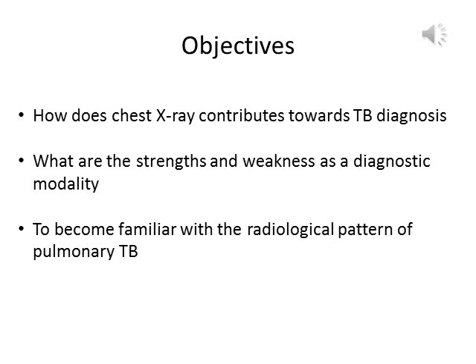However, practical experiences and many studies have shown that no radiographic pattern is diagnostic of TB. Many diseases of the lung show a similar radiographic appearance and can easily mimic tuberculosis. Similarly, the lesions of pulmonary tuberculosis can take almost any form on radiographic picture. So therefore, in this lecture, you are going to learn about how chest X-ray contributes towards TB diagnosis, what are the strengths and weaknesses of this modality as a diagnostic tool, and to become familiar with the common radiological patterns of pulmonary TB.